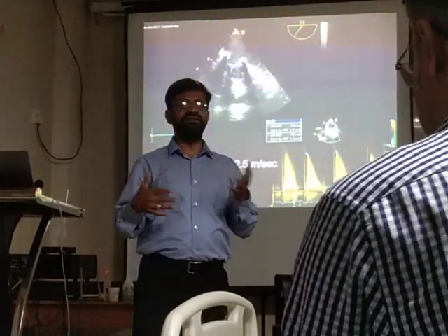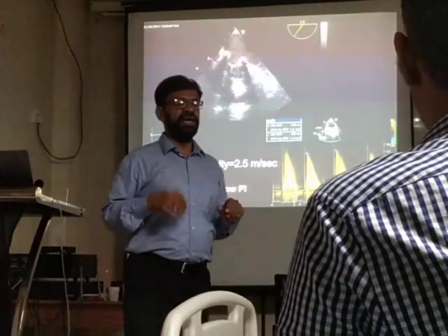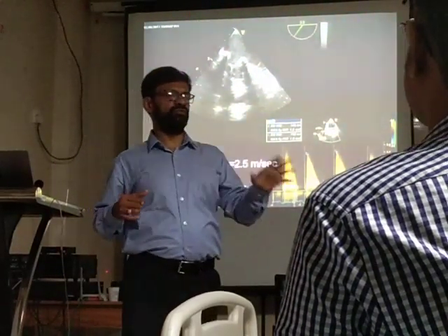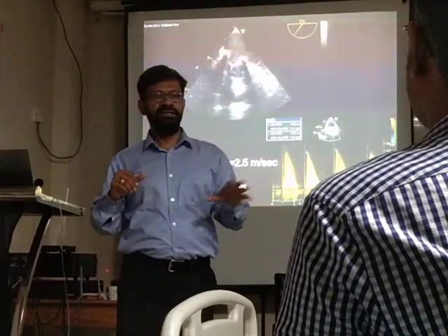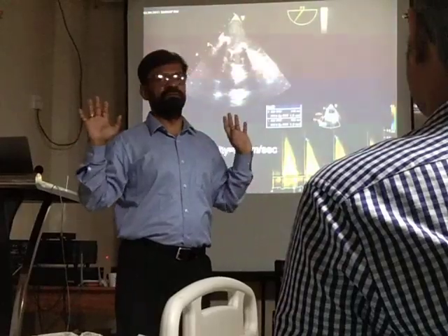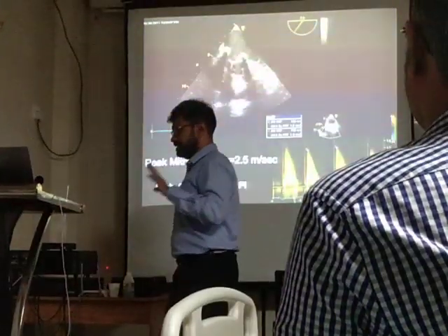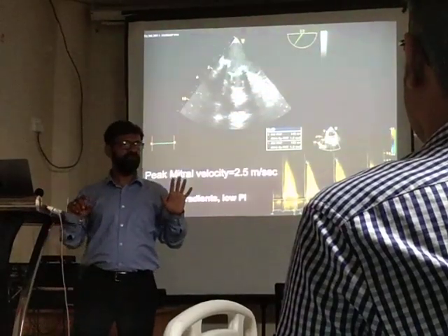But if you are seeing a mitral valve gradient of 20 by 14, you are dealing with a problem. Aortic valve gradients are 20 by 12, 18 by 8. But if you are getting an aortic valve gradient of 32 by 22, it is a problem. Normally, mitral valves, you are dealing with. Okay, any questions till now?